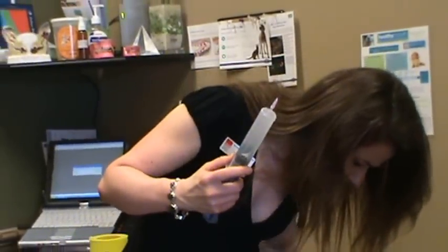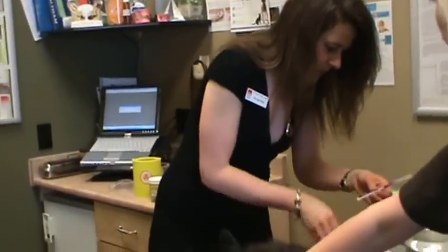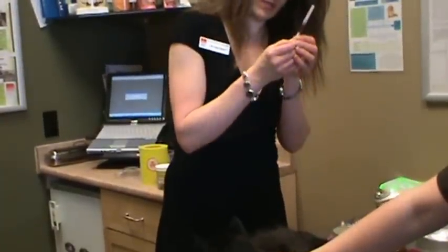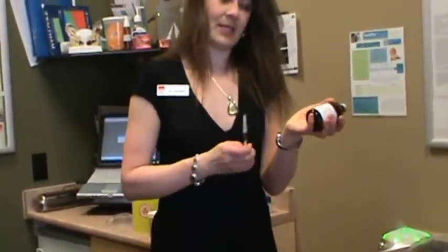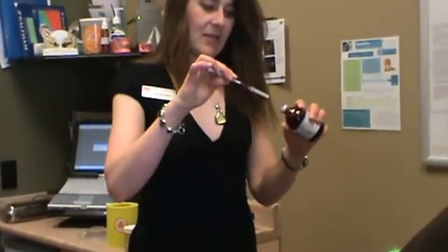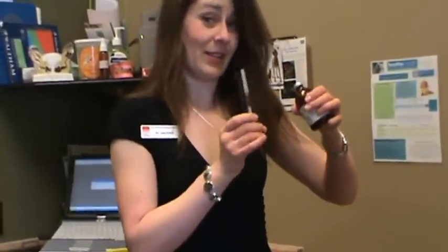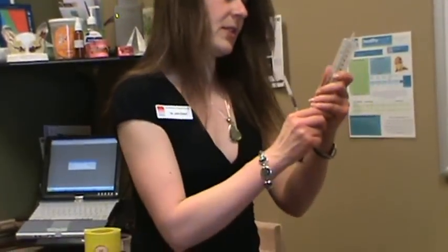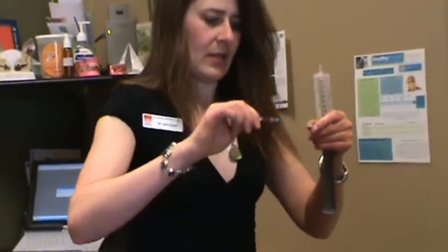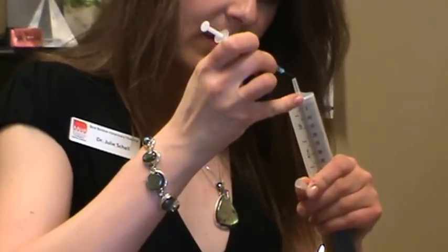Then I put the syringe case back on. In this particular situation, Tracy has drawn up his dose which is 0.25 milliliter, and this is basically what the vitamin B looks like — I will probably dispense a whole bottle to my clients. Then it's the same thing: you just stick the needle in there and draw up to the 0.25 milliliter usually. I'll let you know the correct dose when I dispense it. I suck up a little bit of air, take the needle cap off, and stick the needle right in the bullseye.